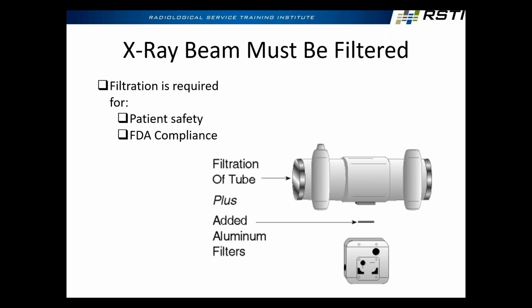Heart's invisible. You might be able to see a faint shadow of where the heart might be in the image. So what the heck do we do? Contrast. Yeah, we inject contrast. For cardiac work, veins, arteries, heart valves, all that stuff, we use iodine. Iodine is up there at 53. So way above that.